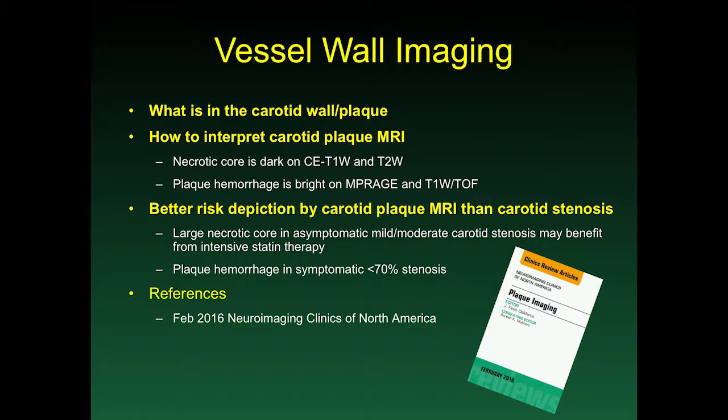The second group is we're going to look at intraplaque hemorrhage in symptomatic patients and add intensive statin therapy with PCSK9 inhibitors. I deliberately didn't give you any specific protocols or techniques on how to do this because you can do it in research mode, you can do it in clinical mode.